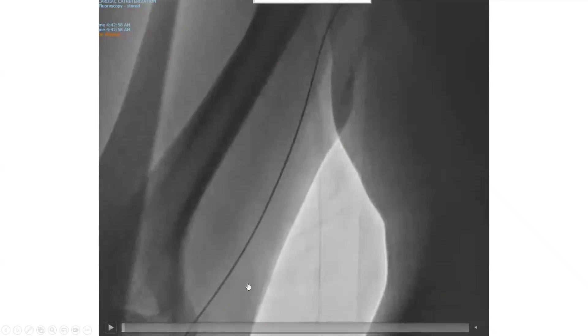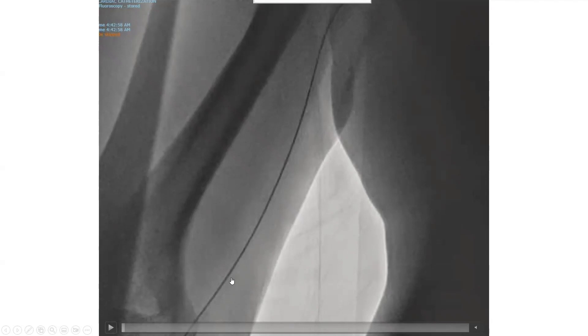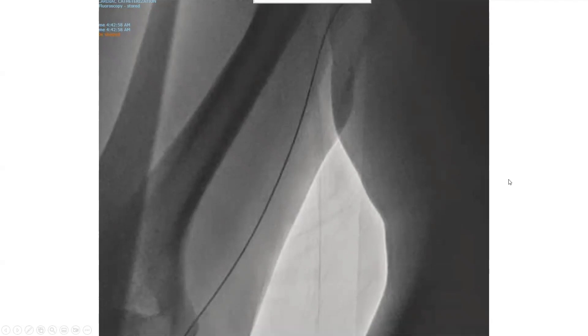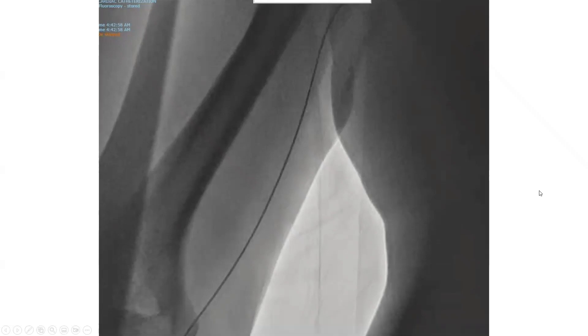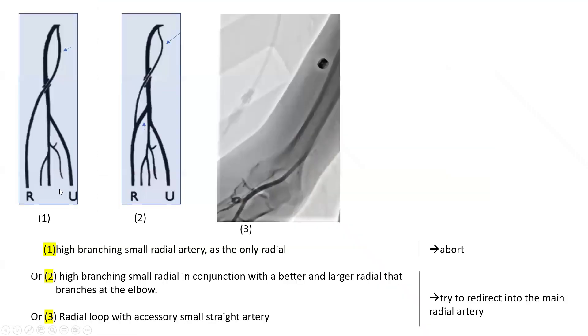What's your next thought? When you see resistance to catheter advancement at this level, think that the wire has gone into a small radial branch which joins the high brachial or axillary artery. It branches off the high brachial or axillary artery, and the catheter could not track over that small radial. There are three options for that small radial you're going into.